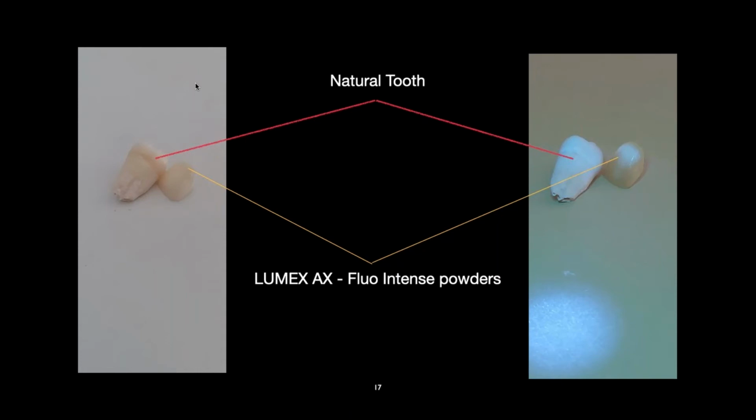What they use now, some expensive dental handpieces are coming with UV lights built in, so that when the clinician is finishing, let's say, a composite filling or resin filling or whatever, when you hit it with the UV light, it may flash over a margin a little bit too much. And by putting on that UV light, they're able to finish, they can tell where the margin is and where the restorative material is. So you don't get any flashing. And that's how they're using UV lights on the clinical side, not just to take the shade of the teeth. They haven't got that far yet.